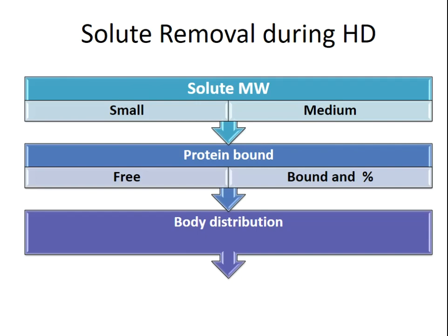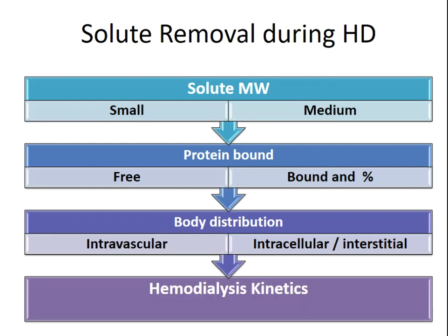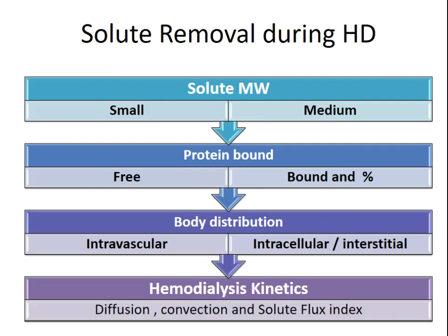Body distribution as well: in the intravascular compartment or in the intracellular or interstitial compartment. And as well hemodialysis kinetics, for example diffusion, convection, and the solute flux index.